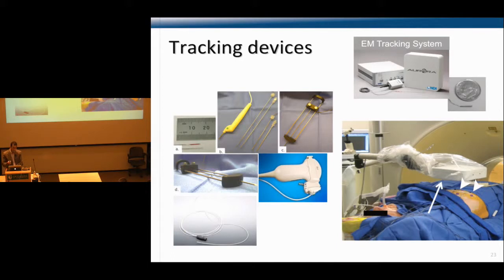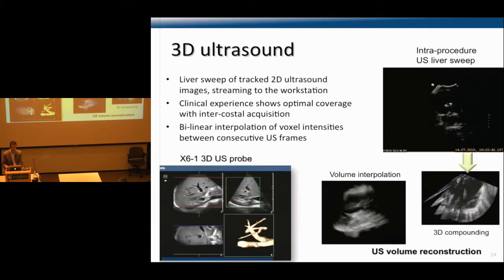That small coil I just talked about, we can embed in thermocouples and in biopsy needles. The system we're using is the Aurora system from NDI. This is a picture of how we set up the generator on top of a patient. Here we see some small markers, which are the manual markers we use for manual registration, and we compare the automatic registration with this point-based, fiducial-based registration. Here we're simplifying the problem into an image-to-image registration problem instead of point-based registration, so we use the ultrasound imaging taken intraoperatively to perform this registration.